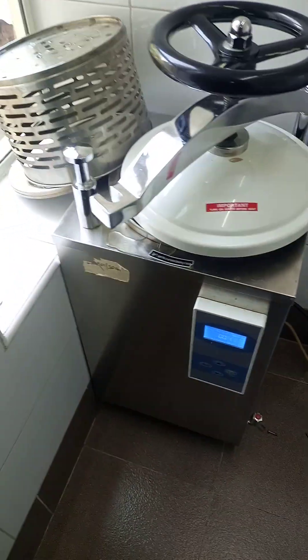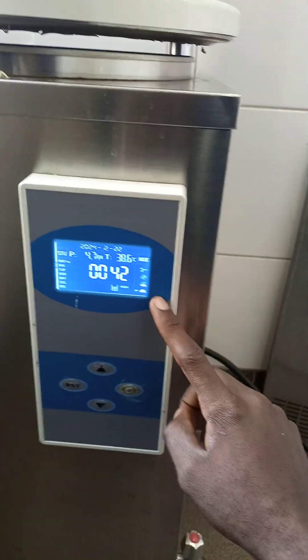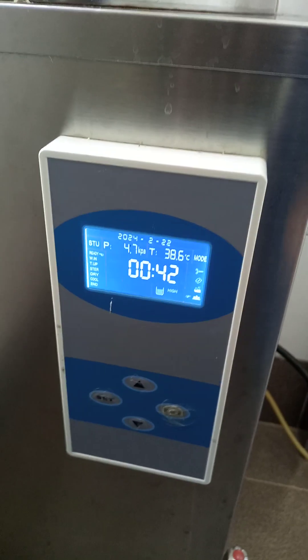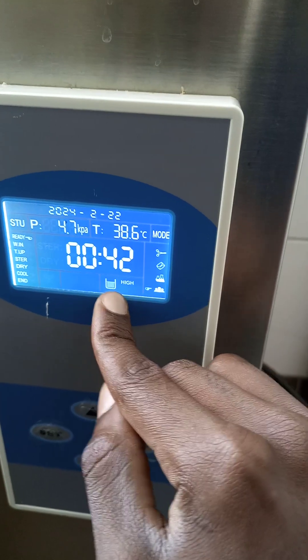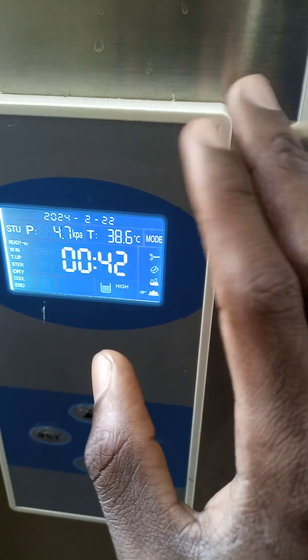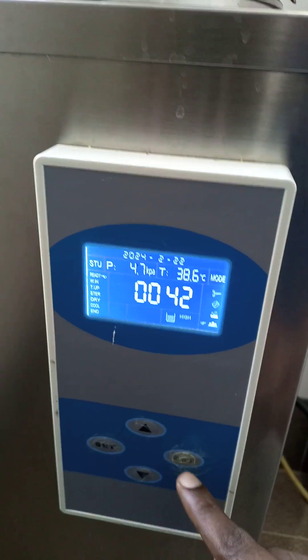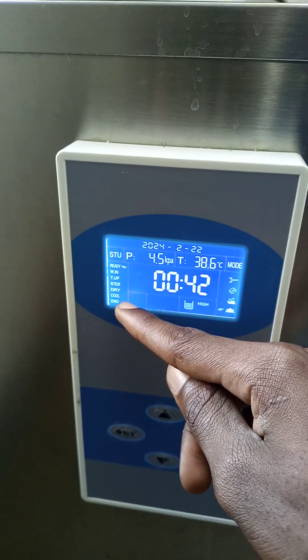So if you look at this autoclave when you switch it on, there is a water level sensor inside. If the water level is up to the threshold, this water level display will show that as static, meaning it's the right water level. Then you can press ENTER and the machine will start running, taking itself through all the processes of temperature, sterilization, and all that.